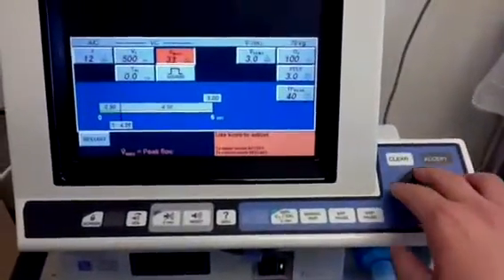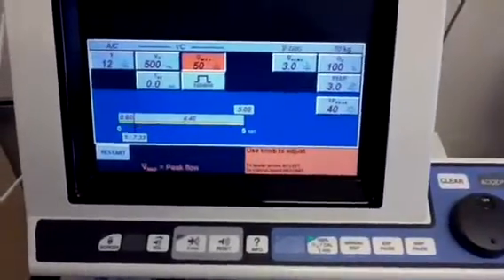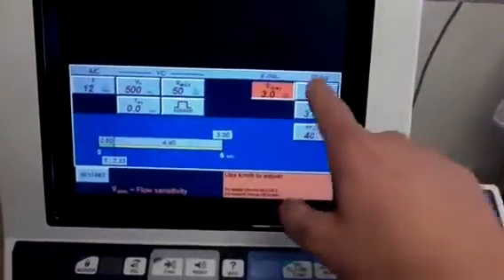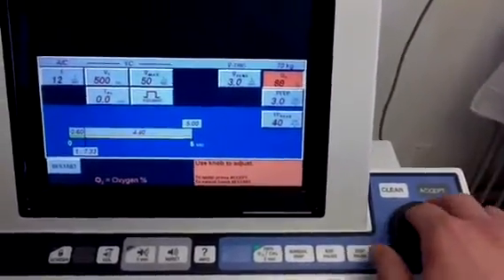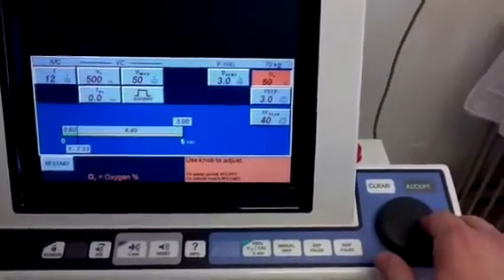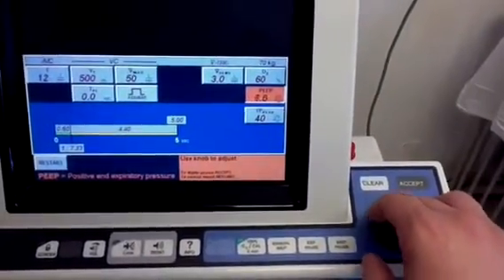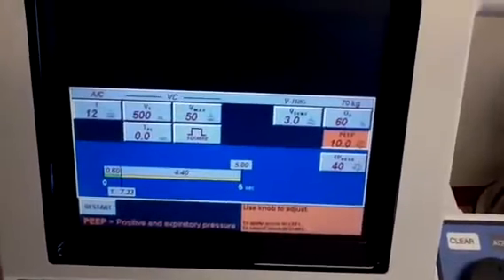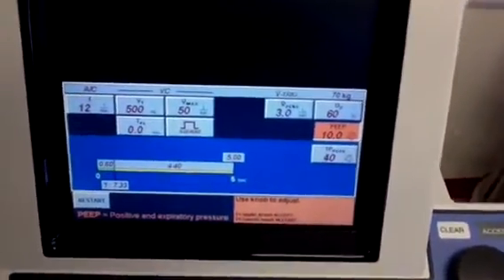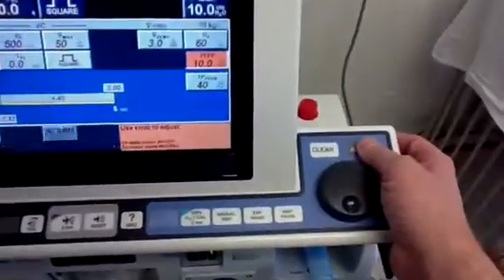Set the tidal volume at 500 and increase the peak flow. A general rule is to take a zero off the tidal volume — so whatever is left, go with that: 50 liters per minute. Keep it on flow triggering. FiO2 can go up or down; we were at 100, so go ahead and select 60% for FiO2 at this point. You can also go up or down on PEEP — let's go ahead and keep it at 10 of PEEP and then hit accept.